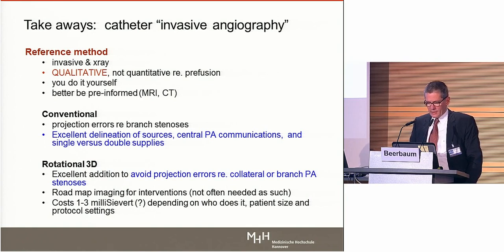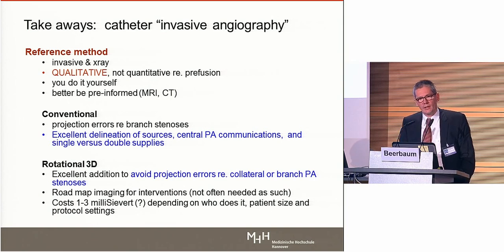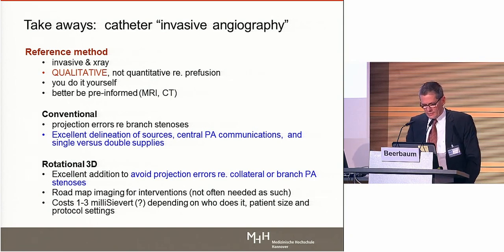Catheter obviously continues to be the reference method. It uses enormous X-ray. People talk a lot about CT radiation, but little about catheter radiation, but it's really substantial. I think that's the big thing, to use those overlay techniques to really be able to bring down the catheter X-ray exponentially in these patients.